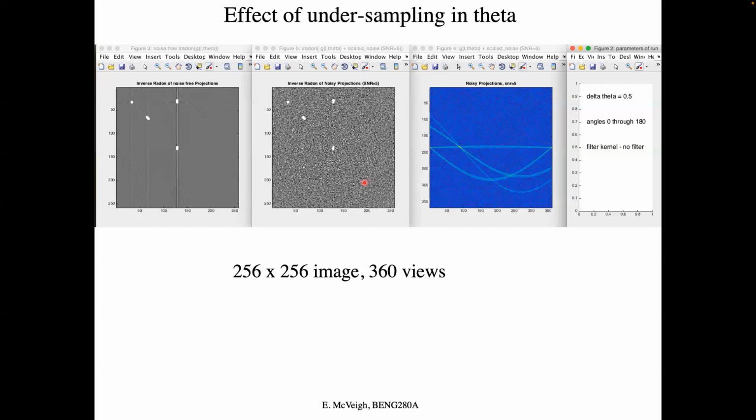So one reasonable way to do samples would be to take a projection every time the detector moved a unit of the detector array. At least the whole thing shifts over by 1 unit, in the detector space.